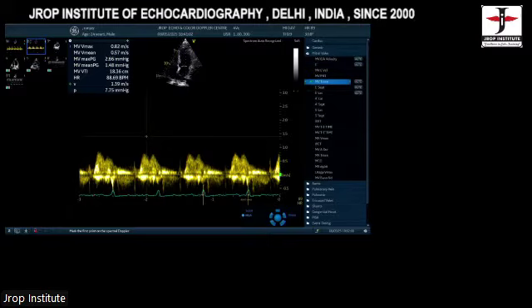What about, sir, across the aortic valve? Across the aortic valve is the same. If you are looking at the LVOT, pulse wave Doppler. If you are looking at the aortic valve with stenosis, then we look at continuous wave Doppler. Thank you, sir.